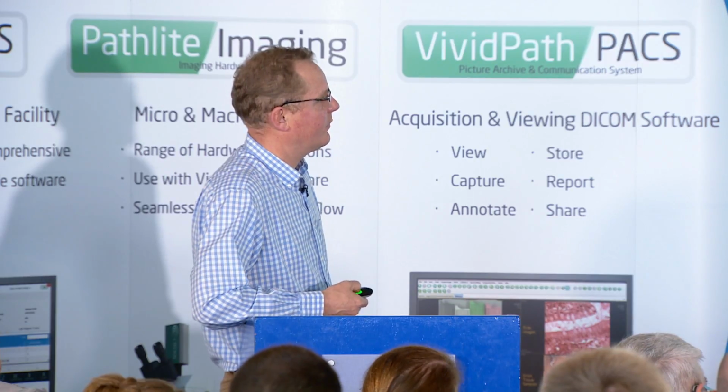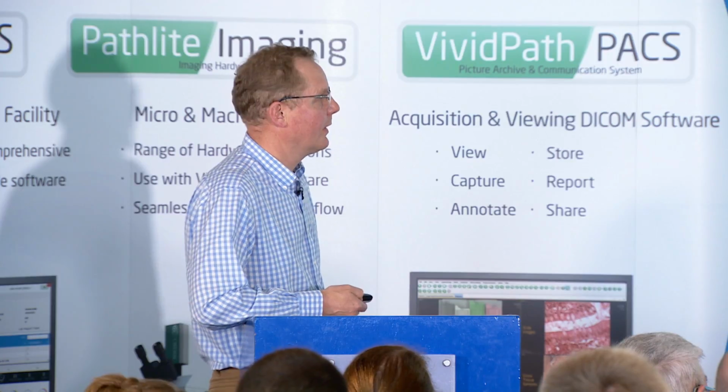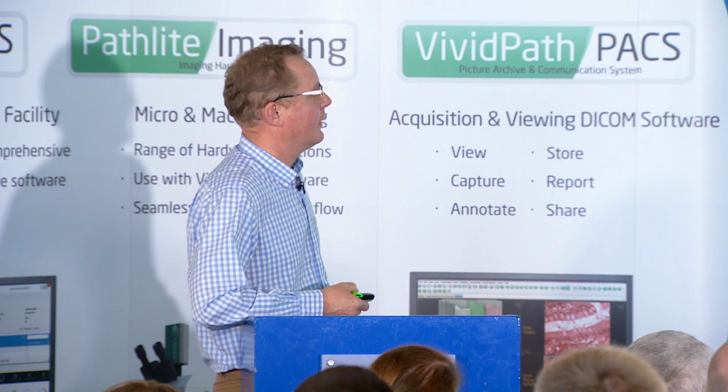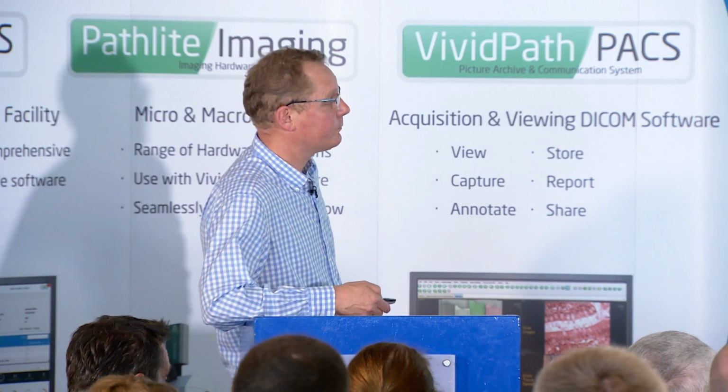So you can get an assessment of the amount of lymphocytic infiltration that's going on in the tumour, and that again is likely to be important in how the patient is doing. That will reflect the way in which the body is already attacking the tumour and the success of that process. So those are things which we think will be useful.